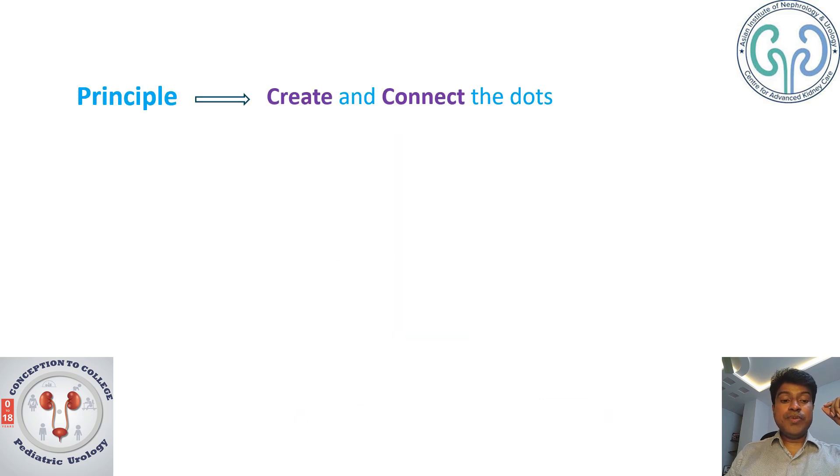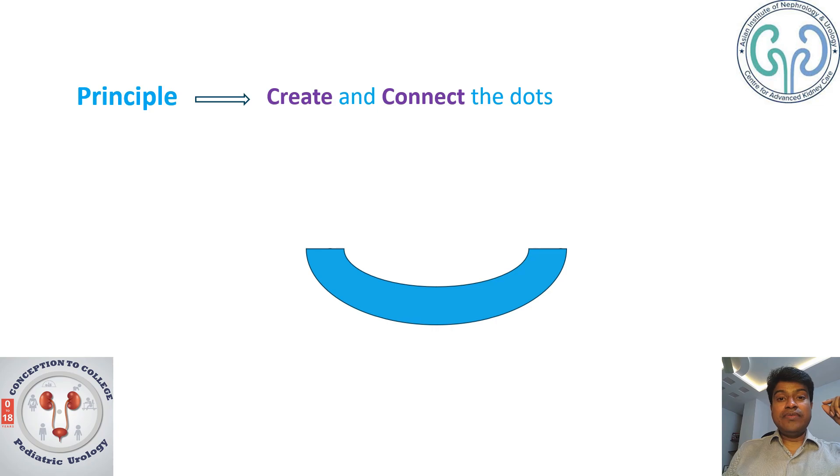The principle we follow is to create and connect the dots. You are creating dots right on the ureterocele, and once you are done creating these dots, all that is left is connecting them. Let us see how the principle works.